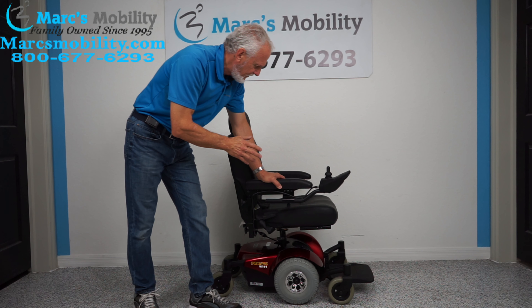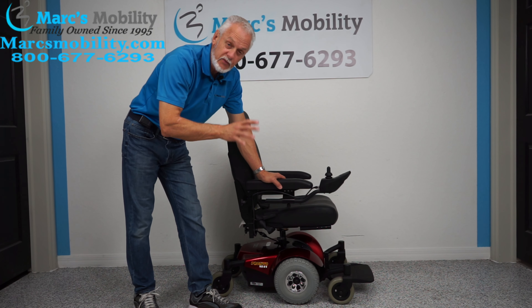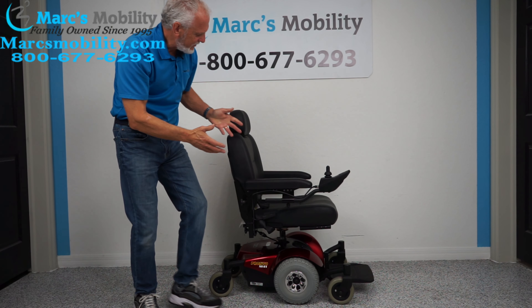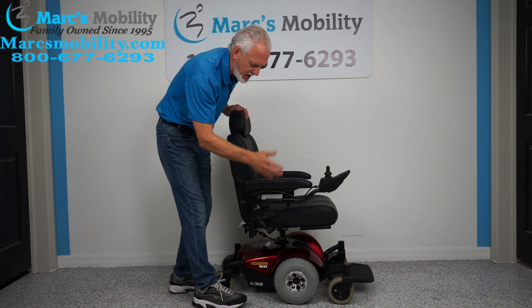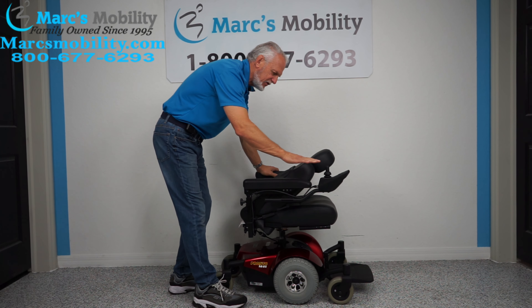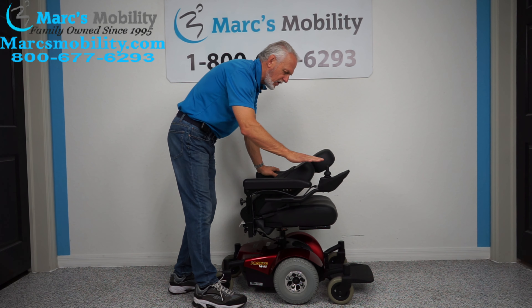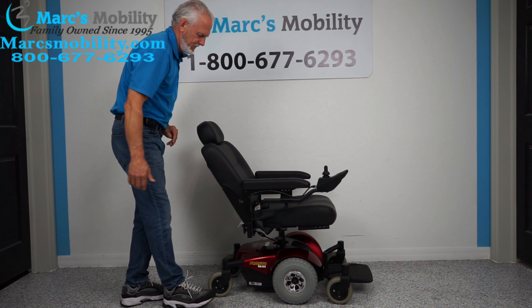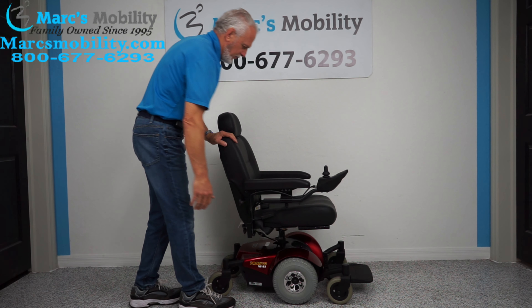This power chair is practically brand new. It was only used for a couple months, so as you can see everything's original. It does have the captain seat, which is nice — you don't see a captain seat on these small power chairs too often. You can fold the seat down, and right here would be about 33 inches for your height. The seat goes all the way back to here, and this would be the driving position.